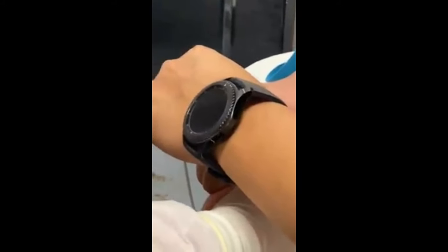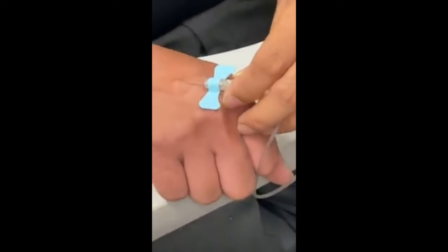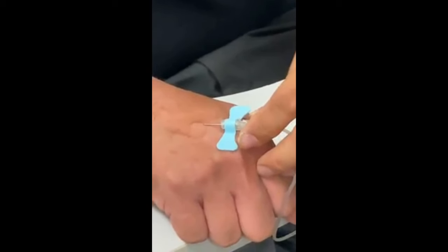Hold on, let me see if it's just on the surface. Because sometimes with these butterfly needles... The veins on the hand are less deep? Yeah, it's very superficial. That's why when you go through and through it, it's right there on the top. You feel it, but usually it's easy to go. Just do 360 with the needle.